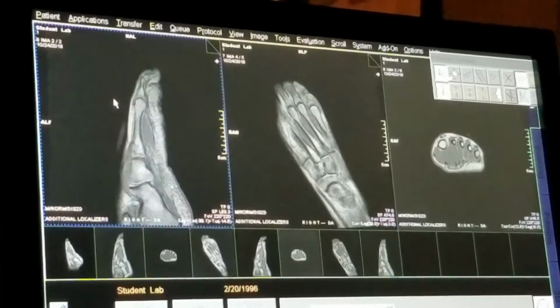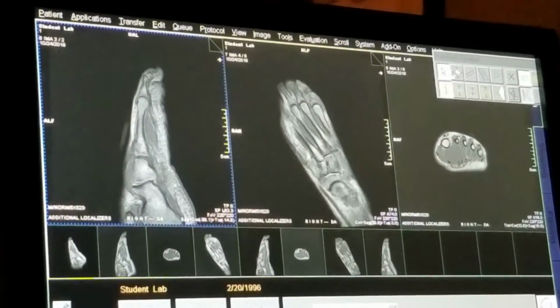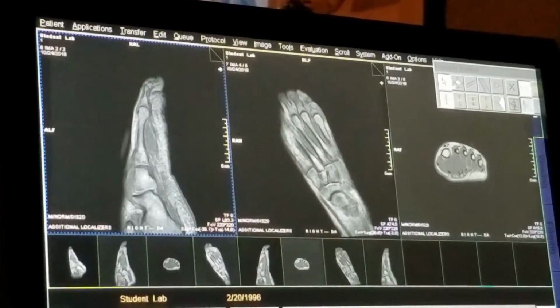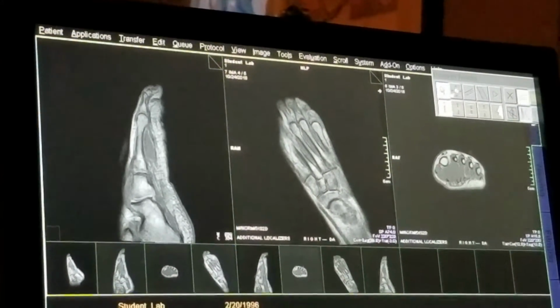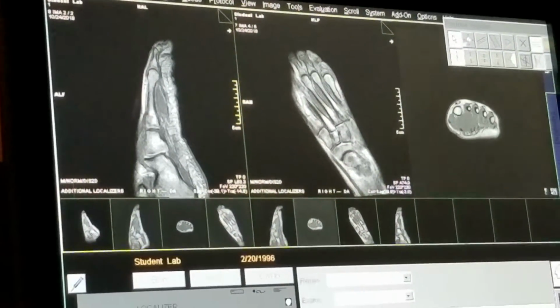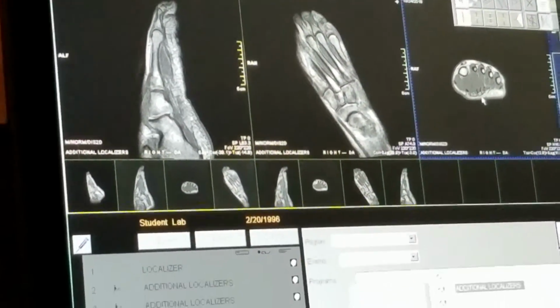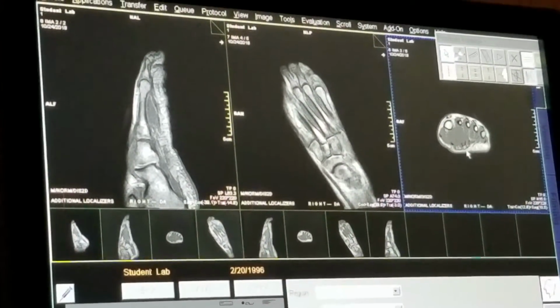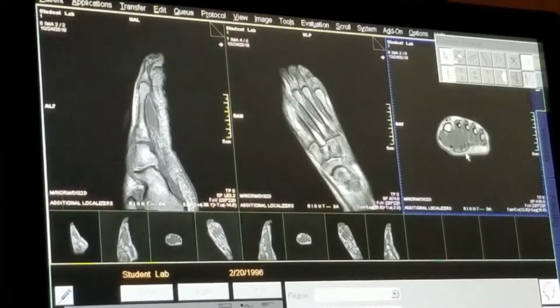So now we have a well-prescribed sagittal localizer, long axis localizer, and short axis localizer. Yes, it took many steps to get there, but from an imaging perspective, the benefits far outweigh the small amount of time spent. And clearly, if I wasn't explaining things to you, I would be going through this a lot quicker, and this scouting process takes far less time.